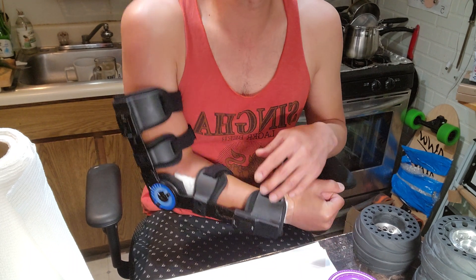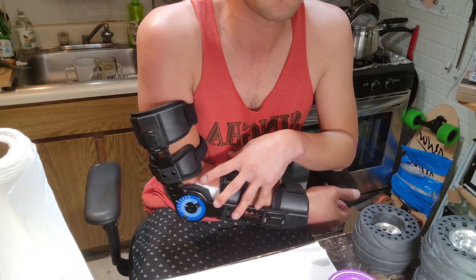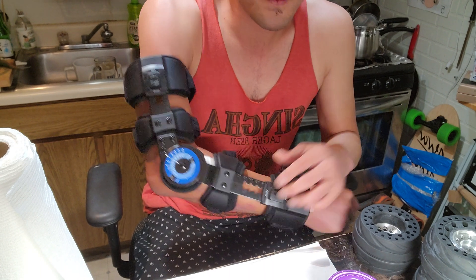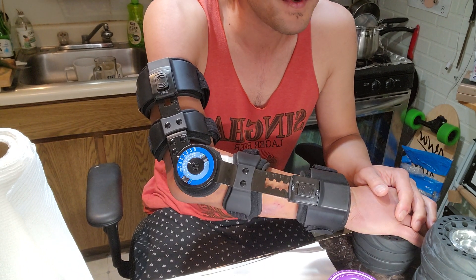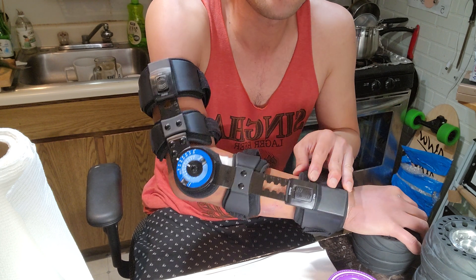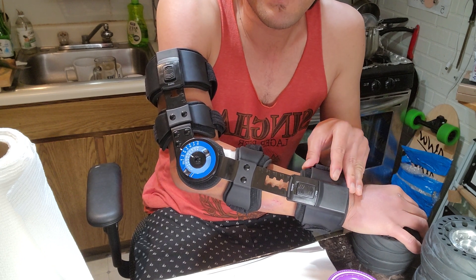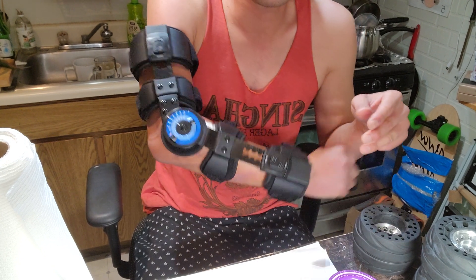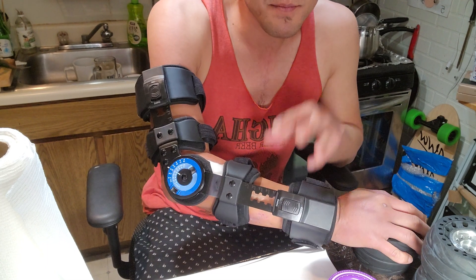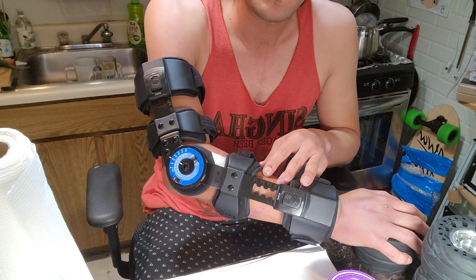This is a pretty cheap Chinese-made gadget — I paid about 60 bucks for it on Amazon — but it's based on the $600 orthopedic version that hospitals use. You can get this for way cheaper; it's not the same thing, but it works and it's really light. This is better than a splint or a cast.